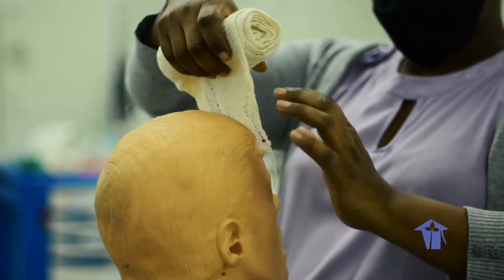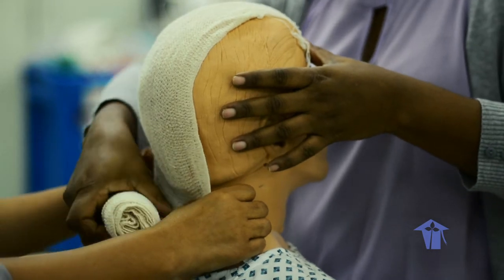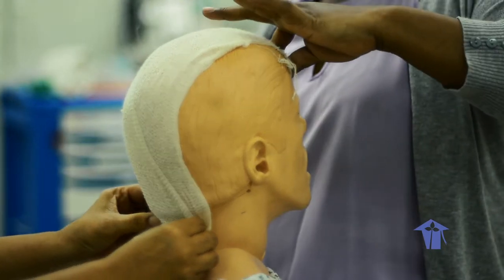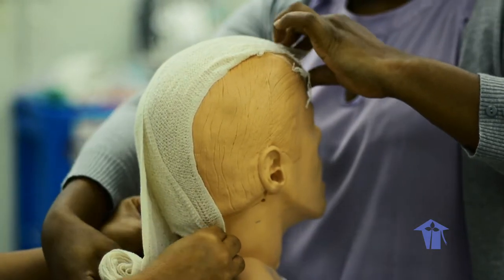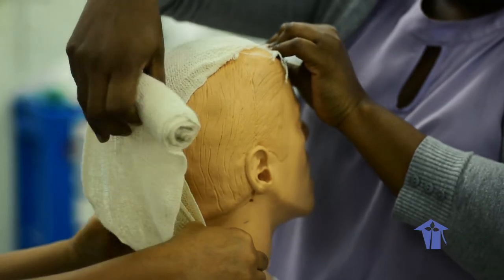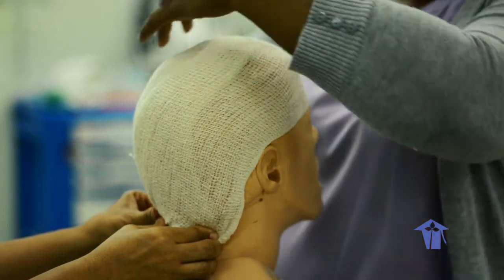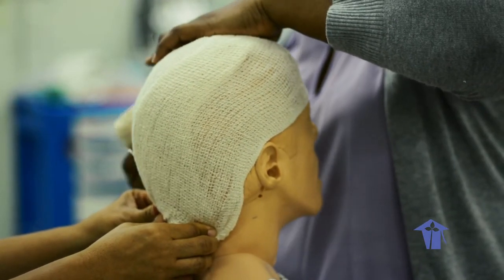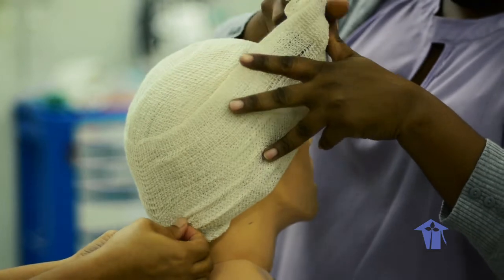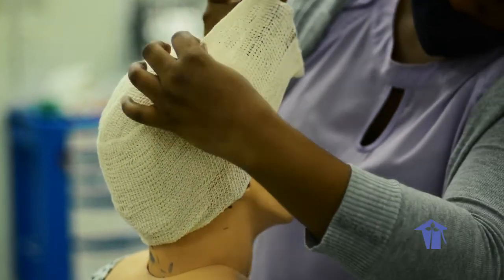We are going to apply the head bandage now. This is also called a turban because that's exactly what it looks like when finished. We start from the forehead to the back of the head, with the assistant keeping the fold in place. Then return the fold up to the lateral side, covering that side of the head entirely, and return the fold to the back of the head, making each fold while keeping a hand in front to pin the bandage in place.